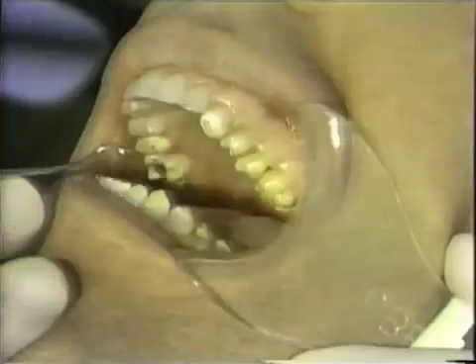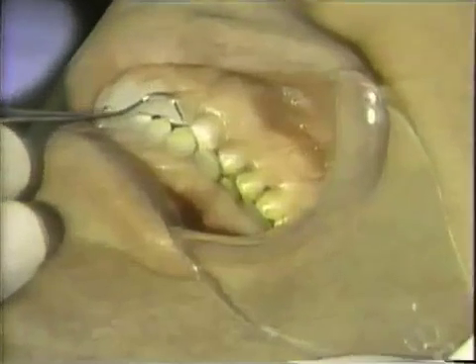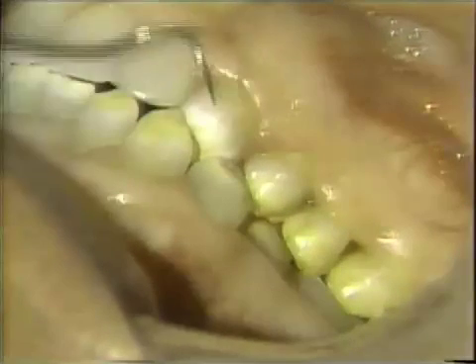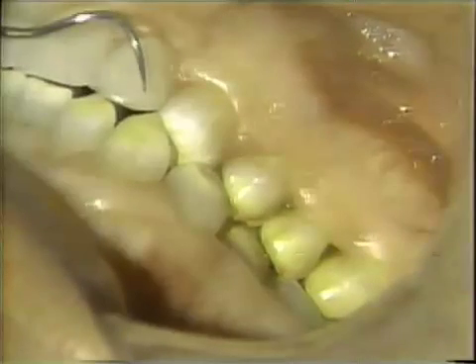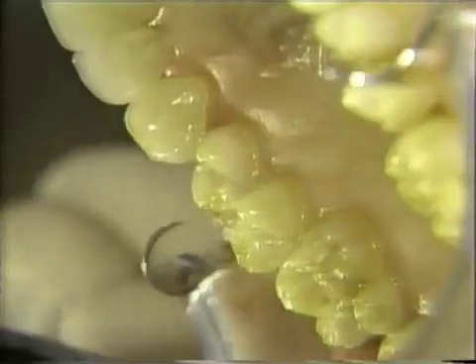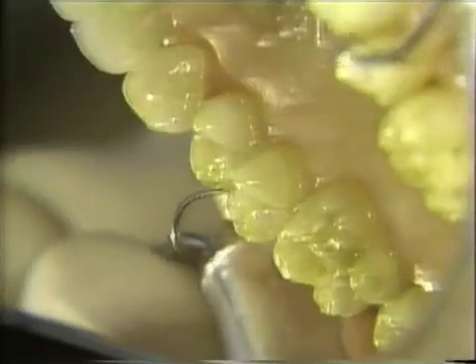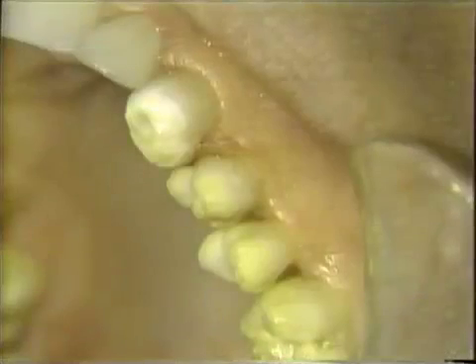You'll notice also that we have an occlusion that will make us take care of some special considerations when we're preparing these teeth for porcelain laminates. There's a crossbite, and our preparation will go over the buccal cusp onto the occlusal surface, taking into consideration the occlusal surface.